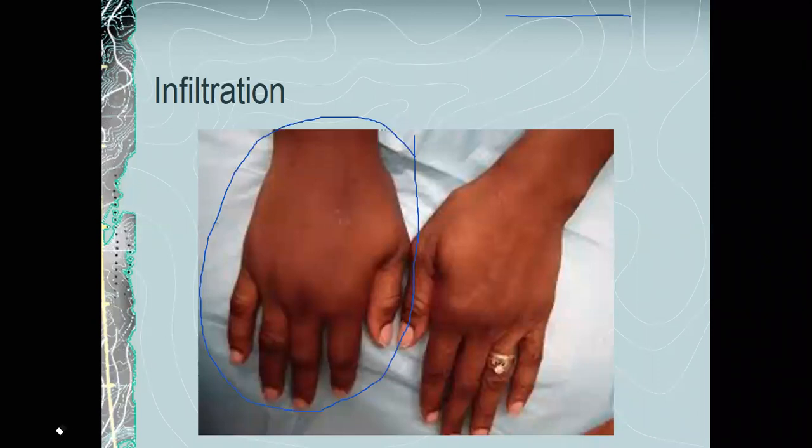You can remember, if you're doing continuous IV therapy, you want to be checking that IV every 1 to 2 hours. So you'll need to restart a new IV. It's going to have to be proximal to the infiltration site. If you had an IV site right here and it infiltrated and you started an IV right here, it's going to be going back up this vein. So that infiltration is going to continue. So you need to do it more proximal. Your IV restarts need to be more proximal to your previous infiltrated site.